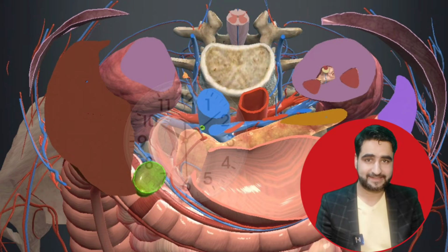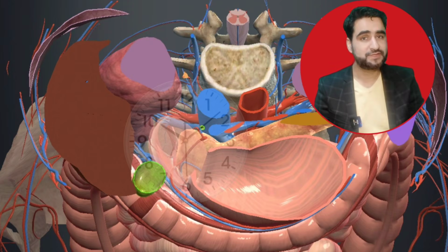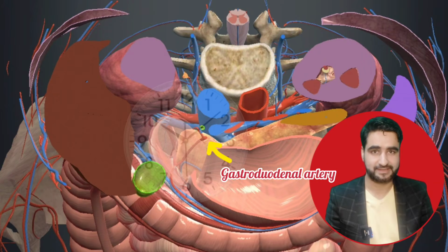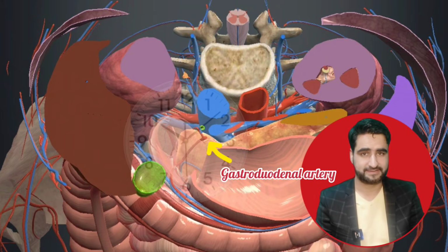Let's reverse direction. Begin rotating the big wheel back towards you until you return to visualizing the portal vein at the 2 o'clock position, your home base. At this neutral position, look carefully near the duodenal wall. You will identify the gastroduodenal artery at its bifurcation point where it divides into anterior and posterior superior pancreaticoduodenal arteries.